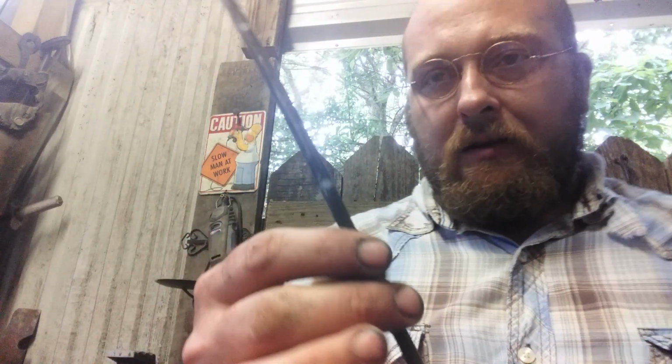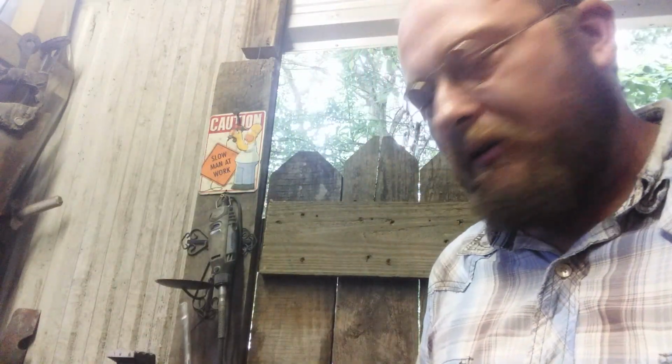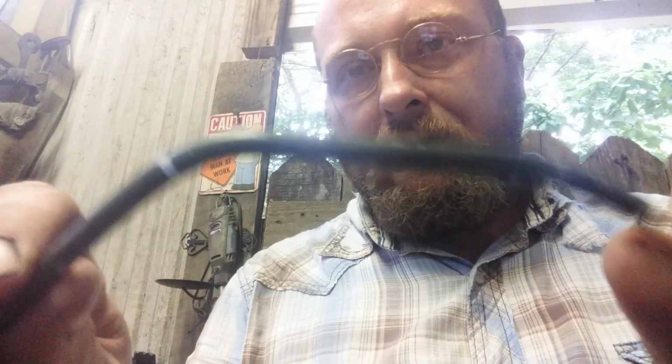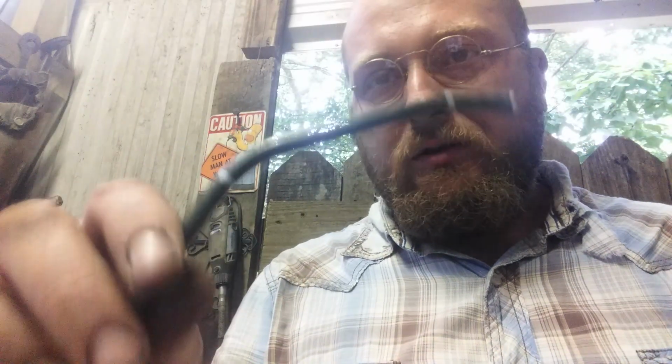So I've cut some pieces of this tubing off to the appropriate length, and I have a brake line bender locked in my vise, and I was able to bend them on the round at 45 degree and about a 30 degree, and that's super light.